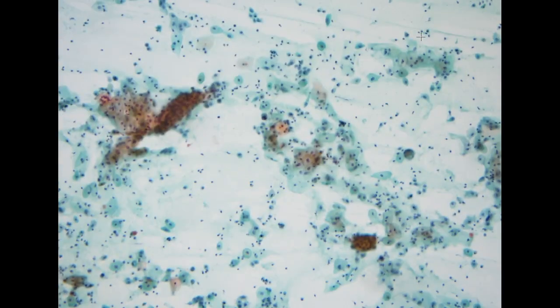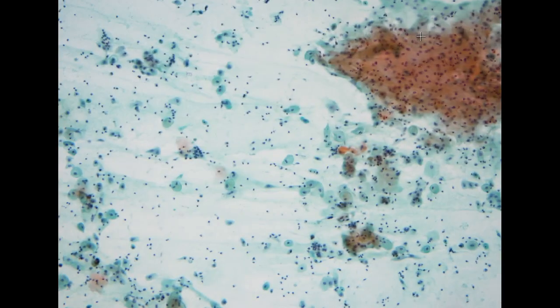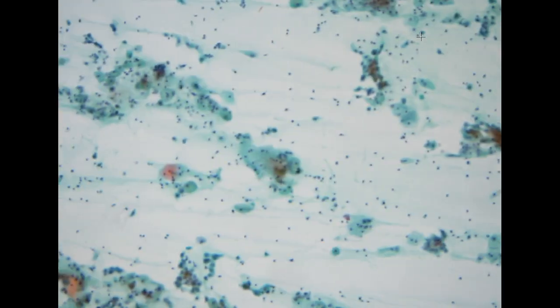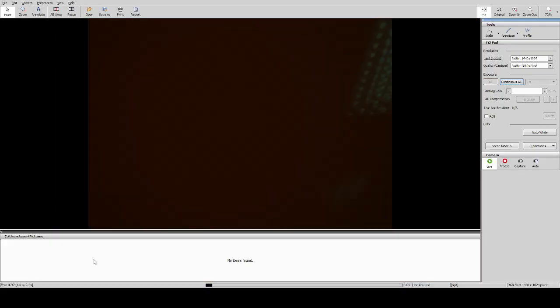Yeah, so sometimes I would say this is not a normal screening scenario, because the patient already had symptoms, and the clinician probably just roughly did a smear and then admitted the patient and did the biopsy. So sometimes we will see discrepancy. Not surprisingly, all from the same gynecologist who is doing a very bad job. And we often have this scenario of discrepancy, all from this one gynecologist.